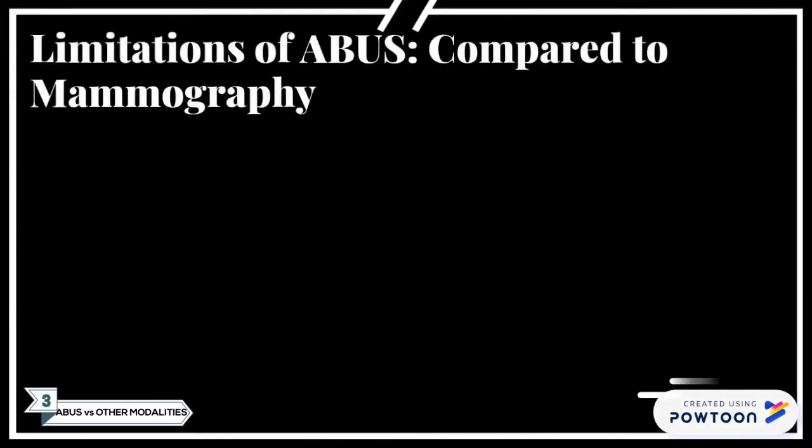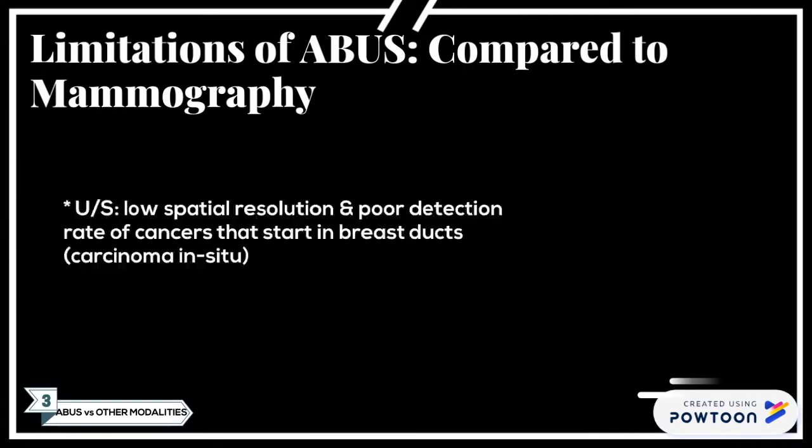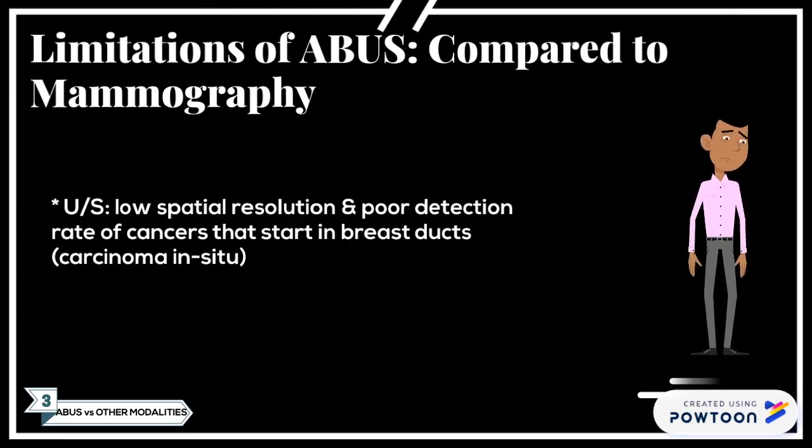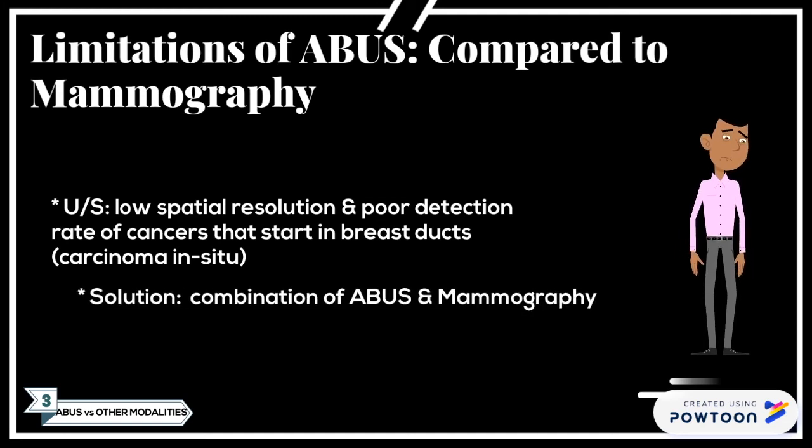Ultrasound-based modalities like ABUS do have important limitations when compared to mammography. This includes low spatial resolution and poor ability to detect ductal carcinoma in situ, which is a cancer that begins in breast ducts. As such, a combination of ABUS with mammography would be more beneficial than either modality alone.